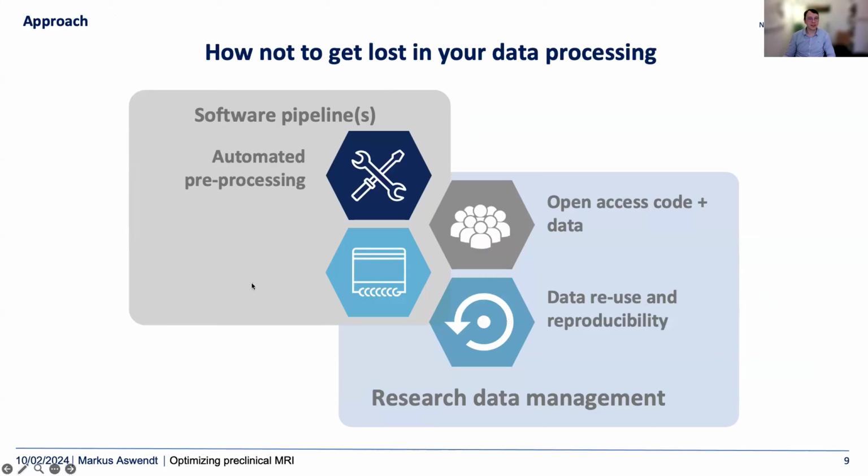And you see here the missing pillar, and this is quality control, because we realized, actually in a very brutal way, that when we want to reanalyze our own data, covering hundreds of mice, we have one main issue, which is to now find out how we can exclude outliers. What is an outlier? So many questions.